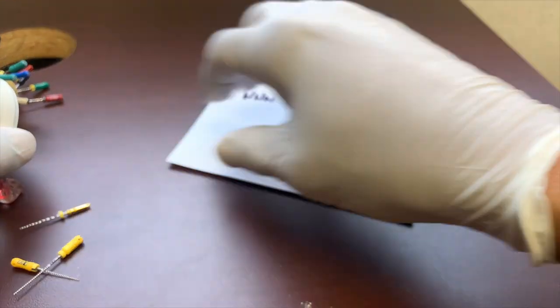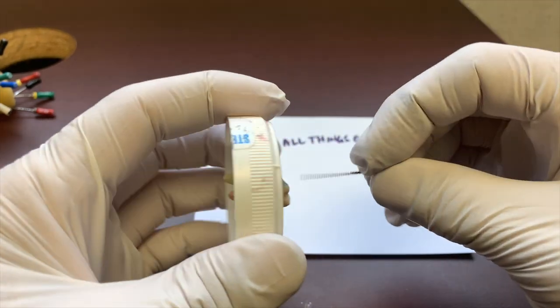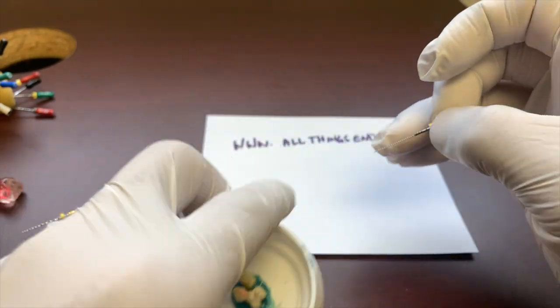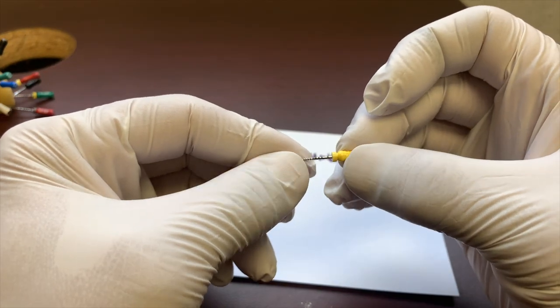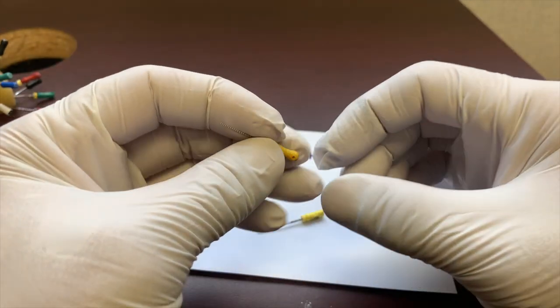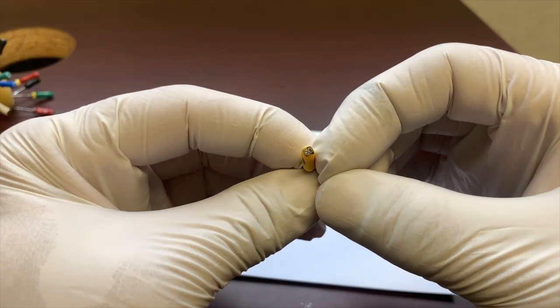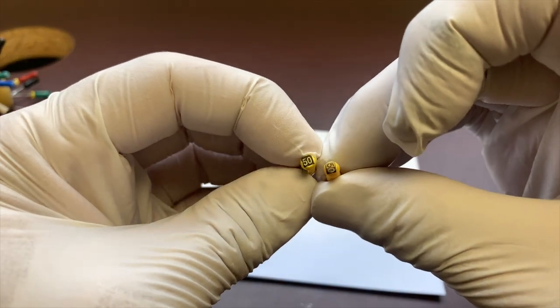So using the balanced force technique in cases like this, you don't even need to, but we recommend it because it's easy to cut dentin. You'll see in a sec. The balanced force technique we were talking about was for stainless steel files. You can still use stainless steel files, they're pretty stiff, but if you've never used nickel titanium hand files, man, they are amazing. You can see the difference on the indicator.